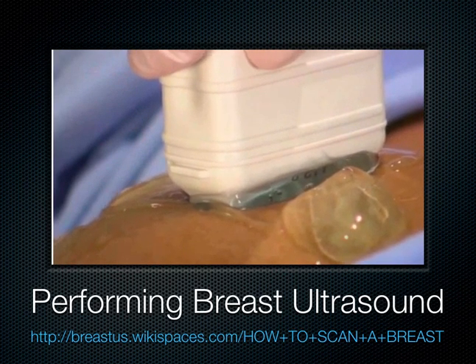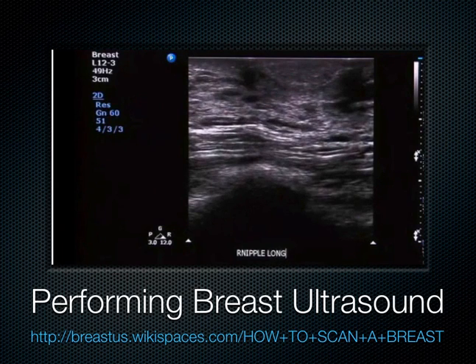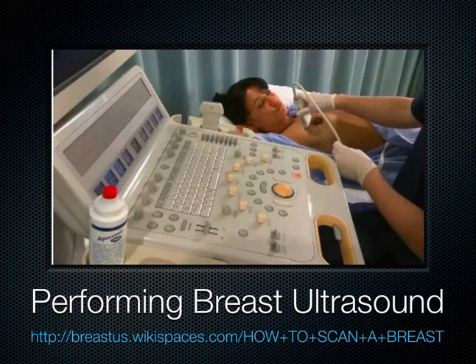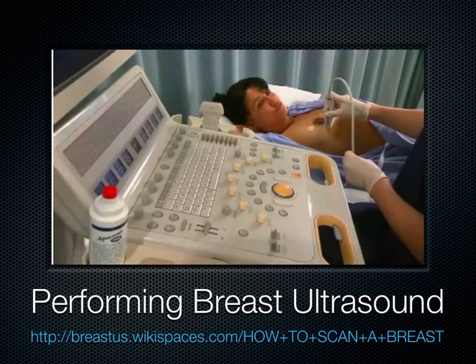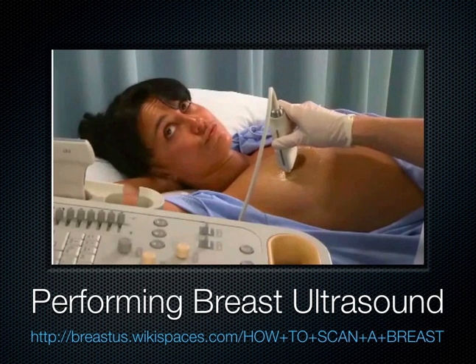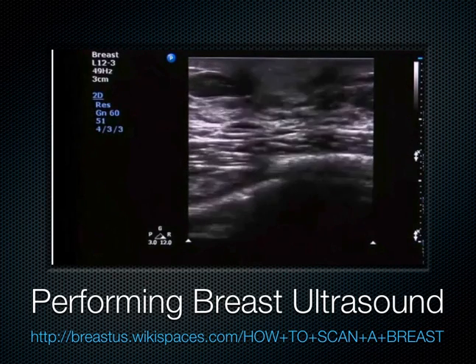Manipulate the transducer until a representative image of the nipple is obtained. Freeze, annotate, and save the image. Repeat the process for the transverse plane by sliding the transducer from the superior aspect of the areola over the nipple and just beyond the inferior aspect of the areola. Return to the middle of the nipple areola complex and obtain a representative image in the transverse plane.